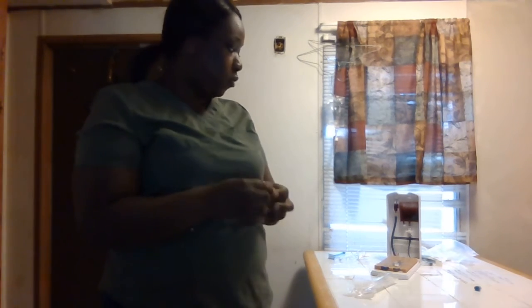So then you program the pump with the correct settings, which my MAR says 500 cc, the normal saline going at 75 an hour. So that's what I'll set my pump on per doctor's order. We can't change it. That's what the doctor ordered. Just program the pump. Make sure you have the right volume.